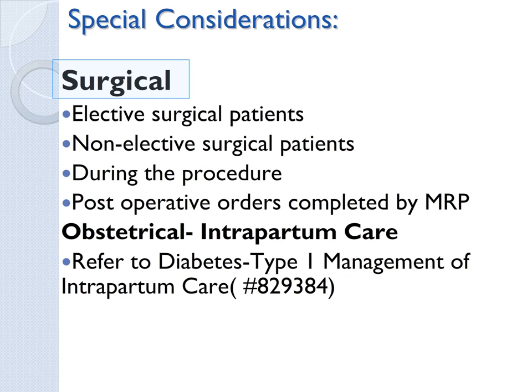Special considerations. For the surgical patient who is having elective surgery, they would complete the forms and have a discussion at the standard face-to-face pre-surgical screening. At that time, a decision can be made by the anesthetist and the patient, depending on the length of the surgery, whether they would use their insulin pump during the surgery. For non-elective surgery, the anesthetist will order the continuation or discontinuation of the insulin pump, again, based on blood glucose control and length of surgery. Postoperatively, insulin orders will be completed by the MRP.